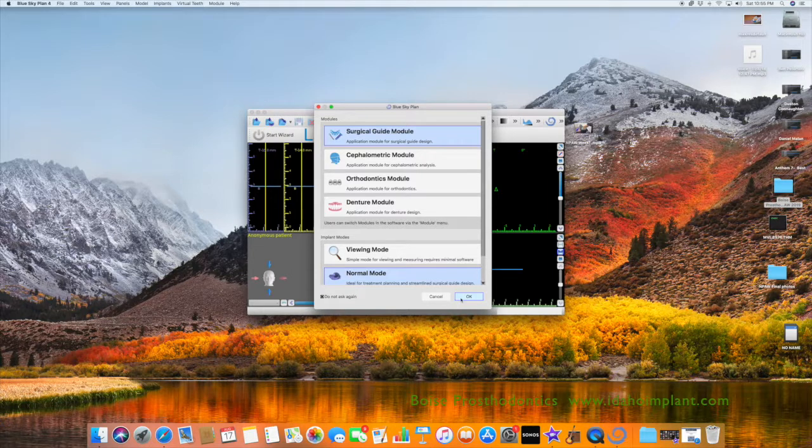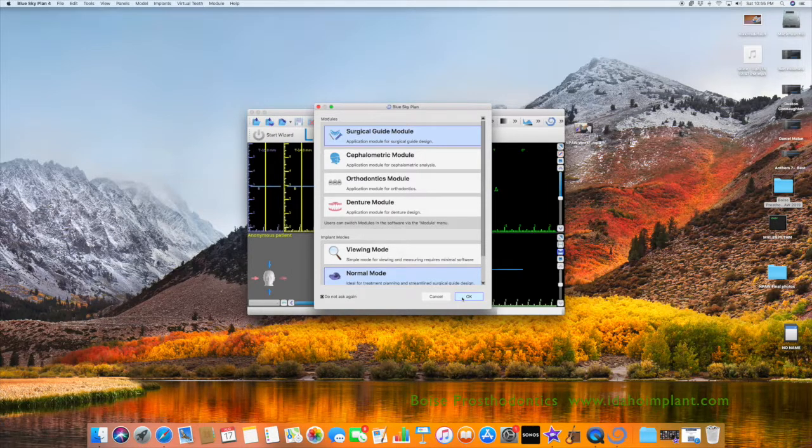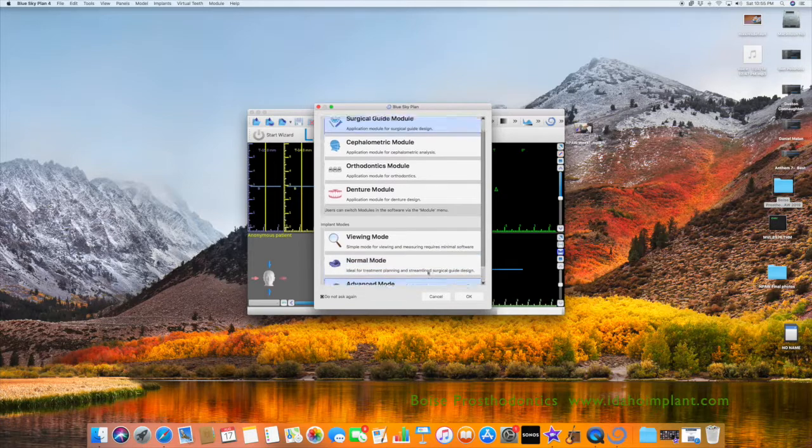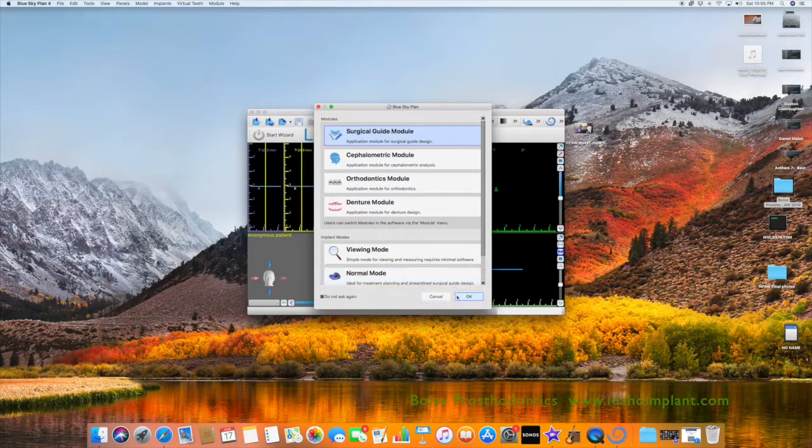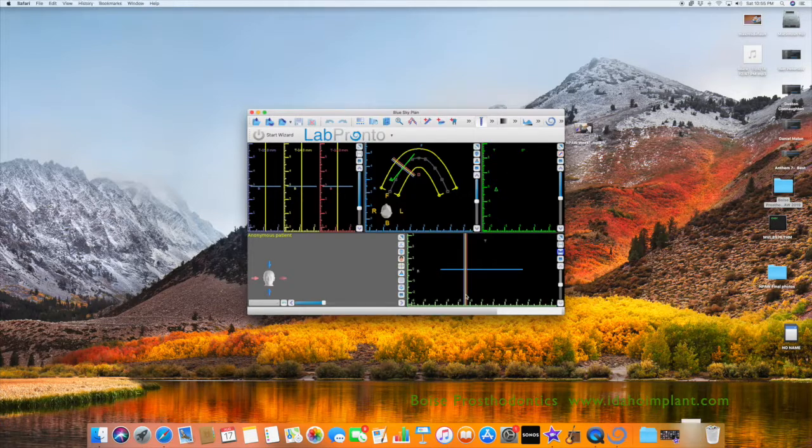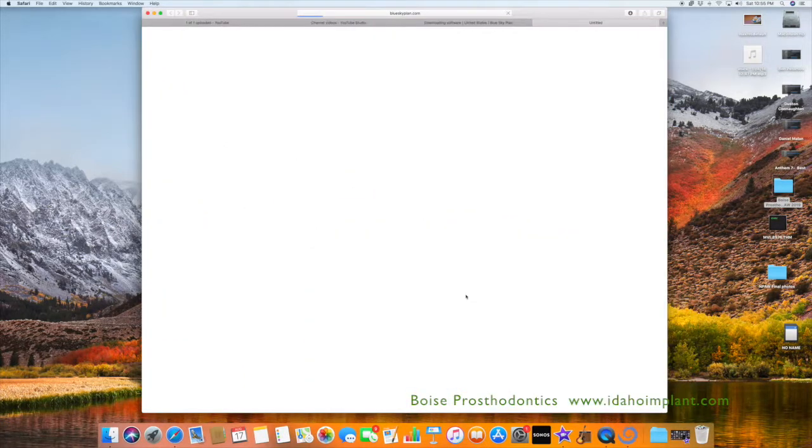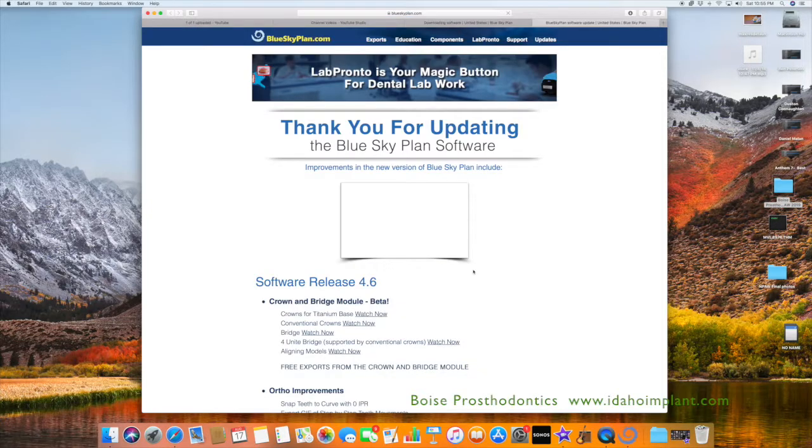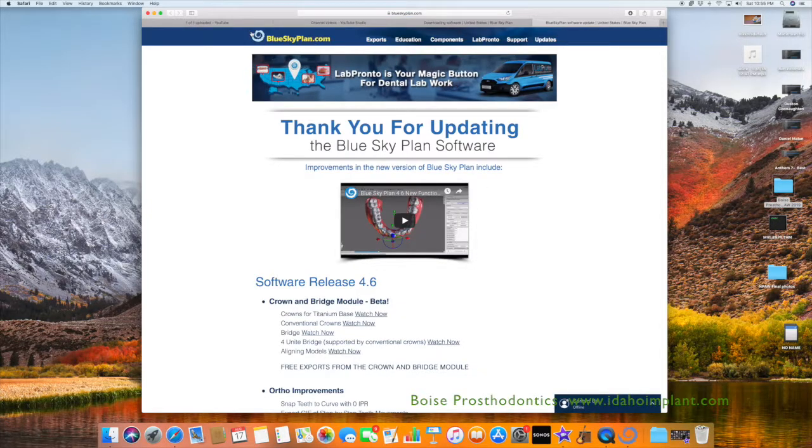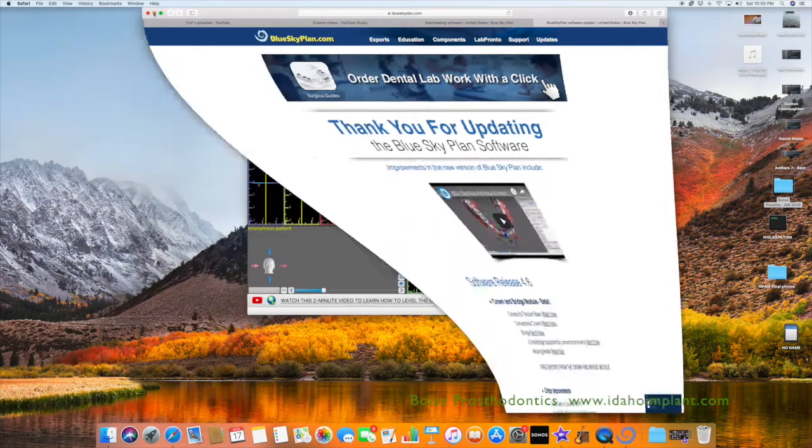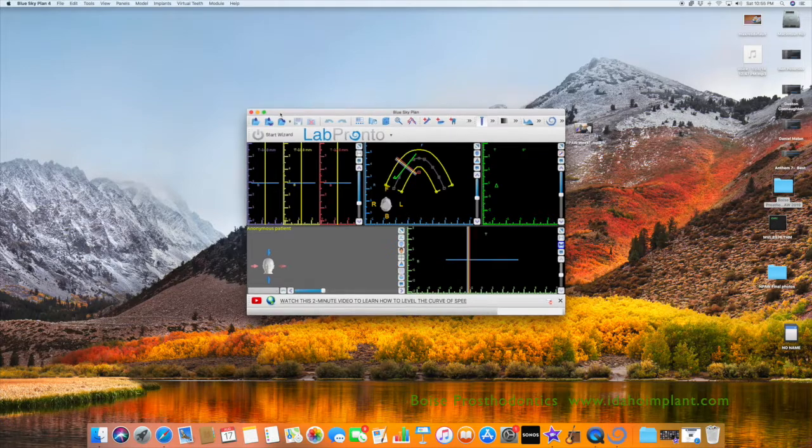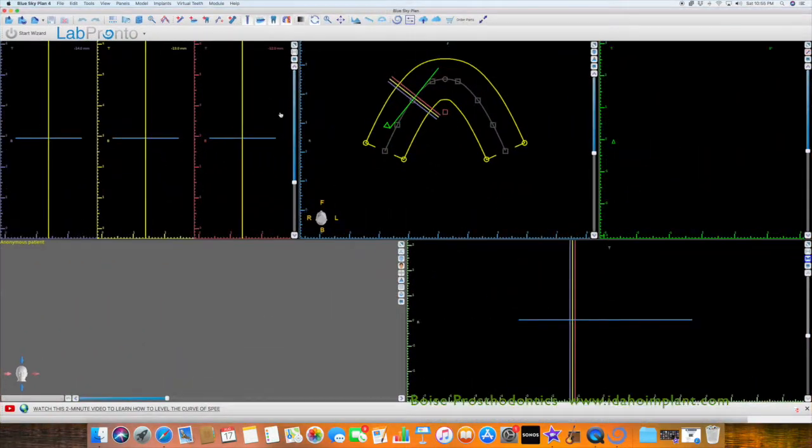Now you can choose which mode you want to be in. I like to be in the advanced mode of the implant planning software. And OK. It will congratulate you for downloading the software and activating it. And now you are ready to use the BlueSkyBio software.